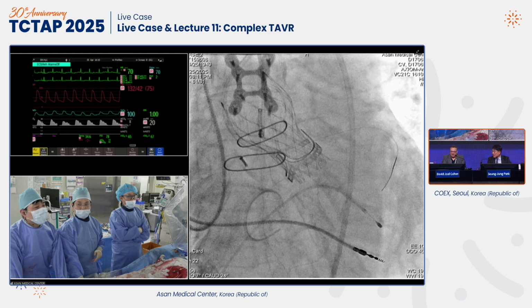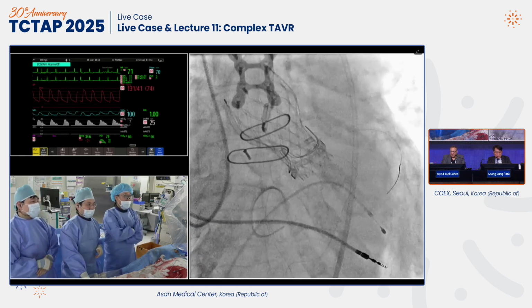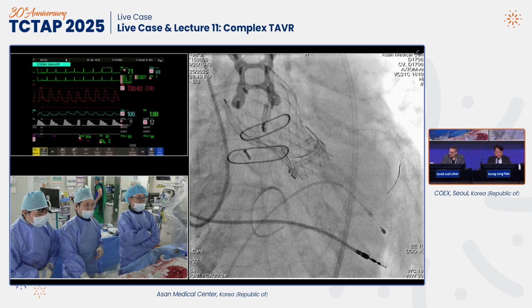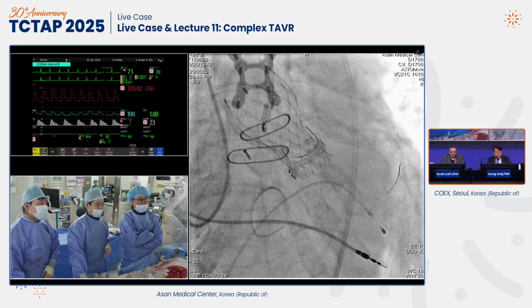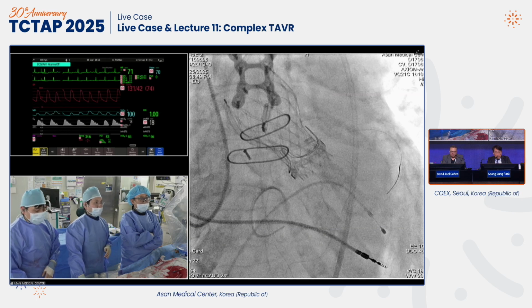It's still one of my favorite cases ever, DW. The patient came out great. We had a good time. But I think what this shows is, you have to plan for the worst and hope for the best, right? That's what we do. So you are prepared for the most serious complication you could have. You've thought about all the different options. You have a stent in place. If you don't need it, absolutely, terrific news.